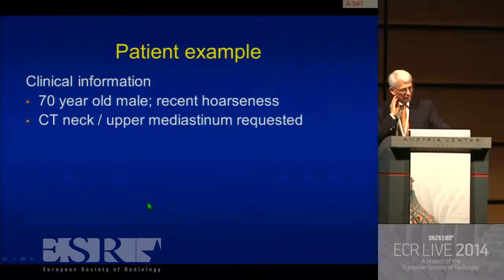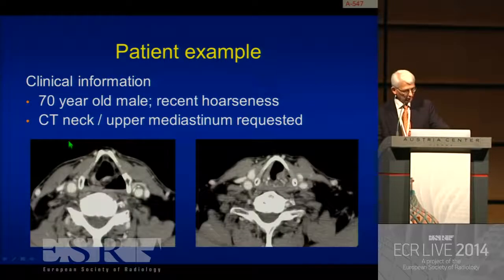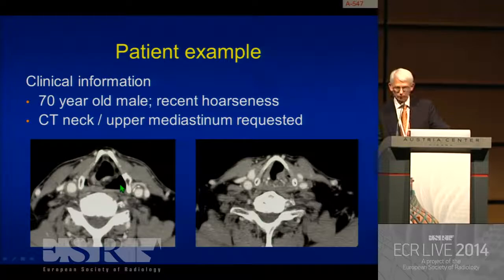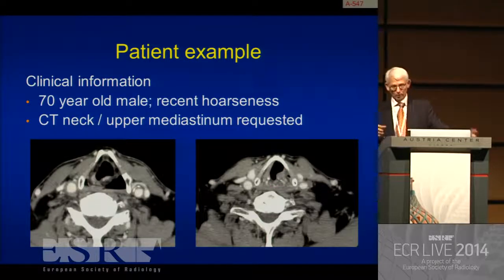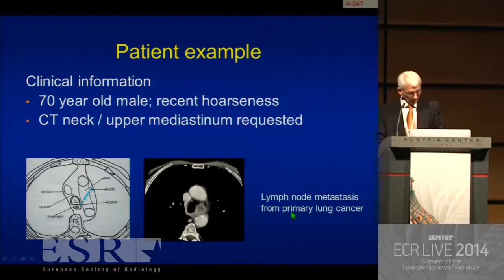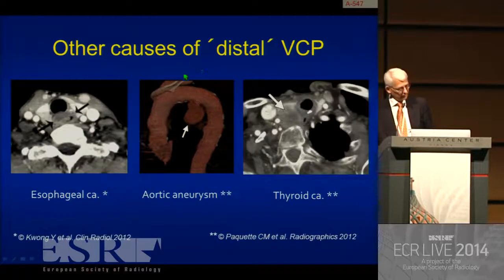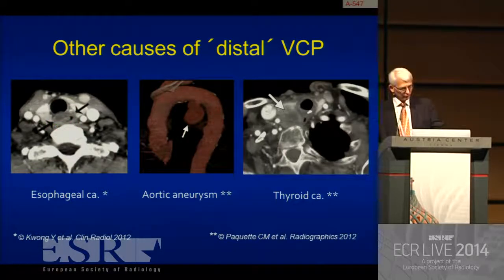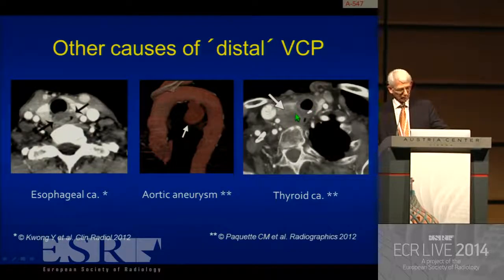A patient example: a 70-year-old gentleman with recent hoarseness. CT of neck and upper mediastinum is requested. At the supraglottic larynx, we see medialization and some thickening of the aryepiglottic fold, dilatation of the piriform sinus, and the sail sign — dilatation of the ipsilateral ventricle. You already know something is happening in those 12 centimeters from the aortic arch to the level of the cord. The lowermost cuts show necrotic lymphadenopathy in the aortopulmonary window — this was a lymph node metastasis from primary lung cancer. Other causes of distal VCP include esophageal carcinoma infiltrating the tracheoesophageal groove, any pathology in the AP window like an aortic aneurysm, and thyroid cancer infiltrating the tracheoesophageal groove.